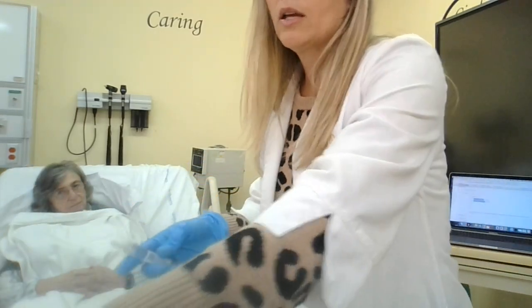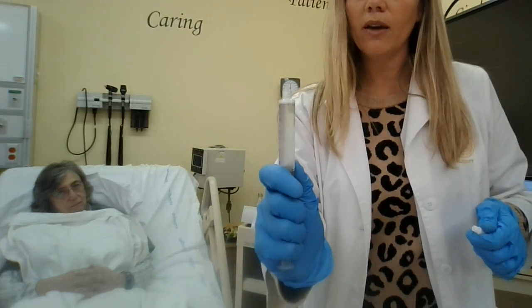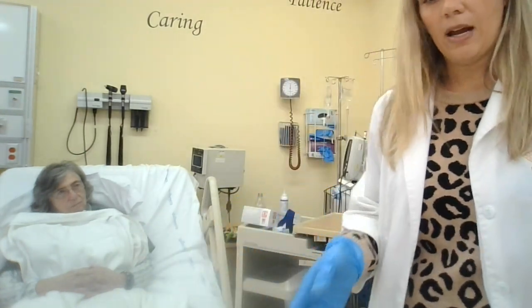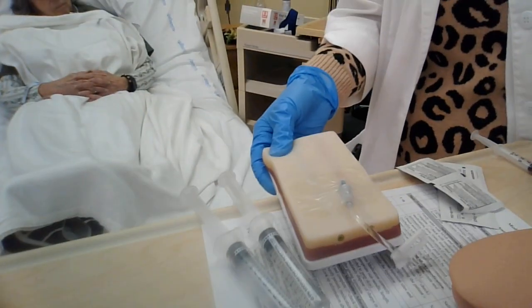Now, another consideration when you're giving an IV push medication is how quickly that you can give it. So when I looked up Lasix under nursing administration, it says give slowly over 1 to 2 minutes. So that means when you administer the Lasix, we're going to give it over at least 1 to 2 minutes.